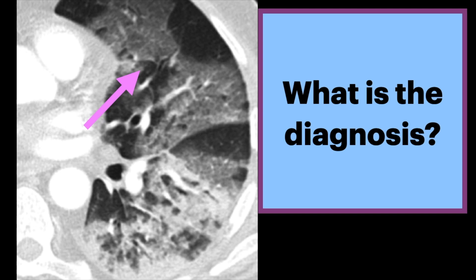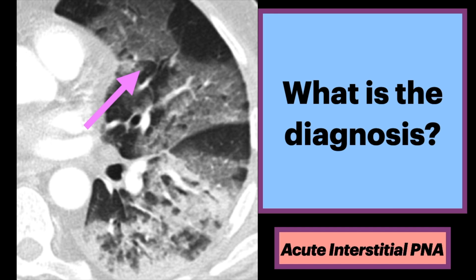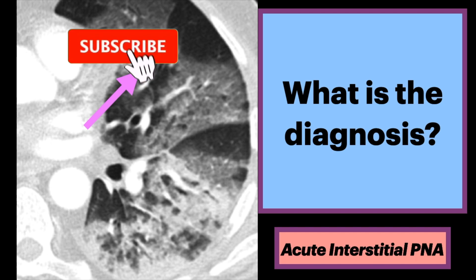What is the diagnosis? We see patchy bilateral ground glass opacities with some sparing of individual lobules, producing a geographic appearance. Dependently, there is dense opacification. These findings can be nonspecific, but in this case the diagnosis was acute interstitial pneumonia, or AIP.